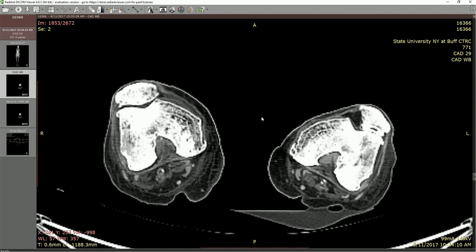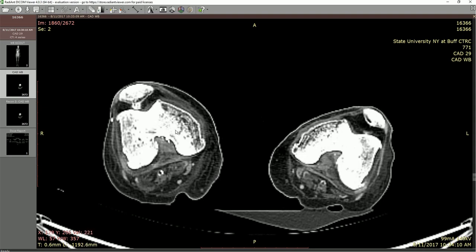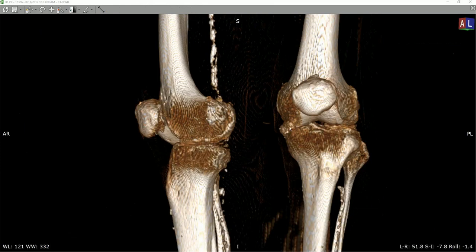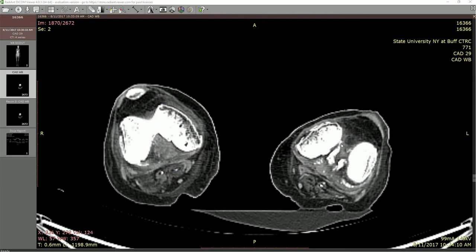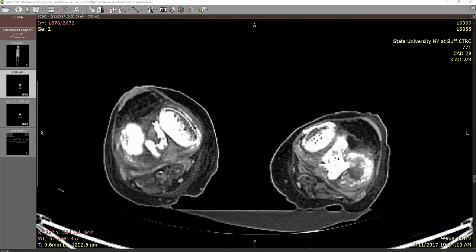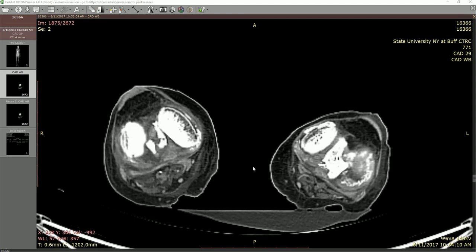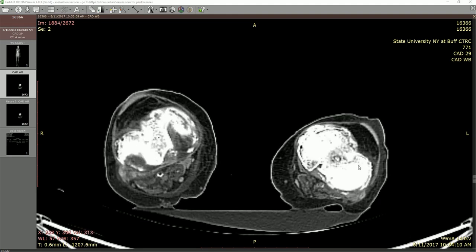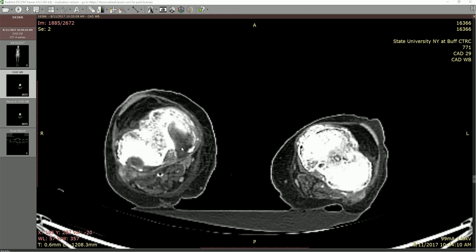Moving further down, we start to see the condyles of the femur spread apart. Here we have the separation on this side, so we're at the level of the tibial plateau — the rise in the middle of the tibia on either side of the condyles. This would also represent the spot at which the ACL and PCL would be attached. Going a little further down, that's going to start to show some meniscal tissue, though given the age of the individual I'm not sure how much will be visible. Now we're starting to see the medial and lateral tibial condyles, right at the top part of the tibia.